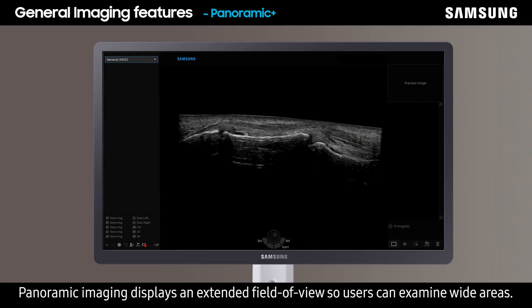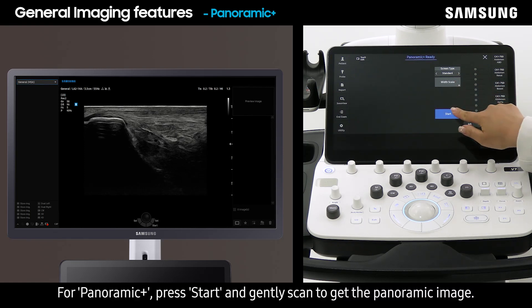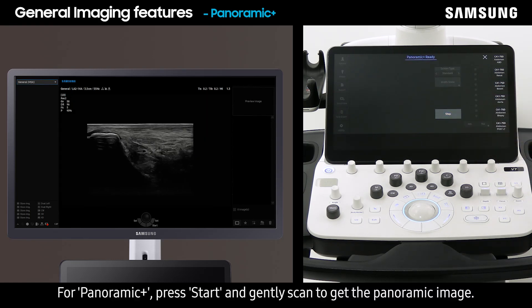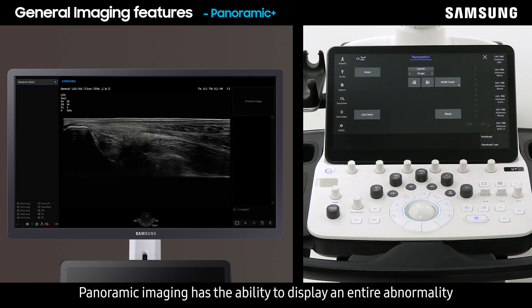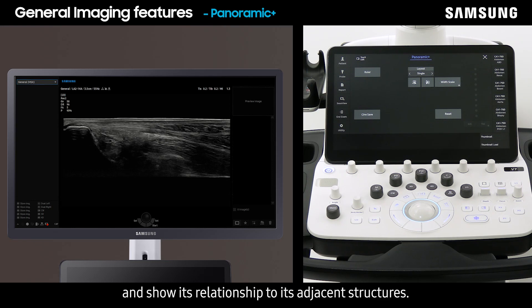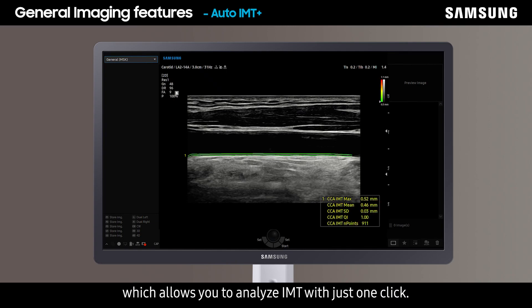Panoramic imaging displays an extended field of view so users can examine wide areas. For Panoramic Plus, press Start and gently scan to get the panoramic image. Panoramic imaging has the ability to display an entire abnormality and show its relation to adjacent structures. The last feature to introduce is Auto IMT Plus, which allows you to analyze IMT with just one click.